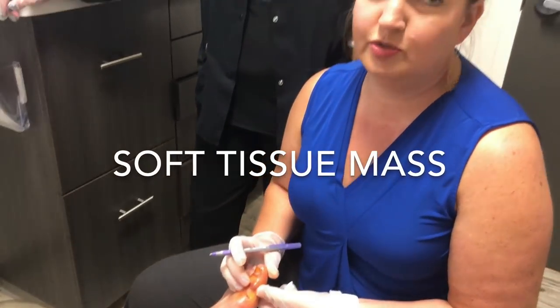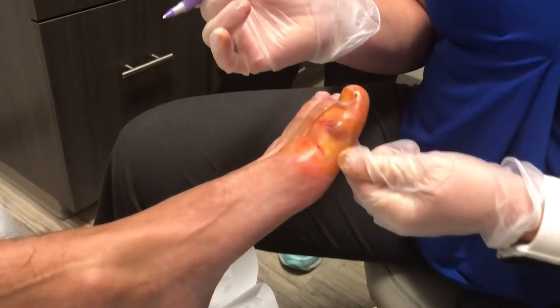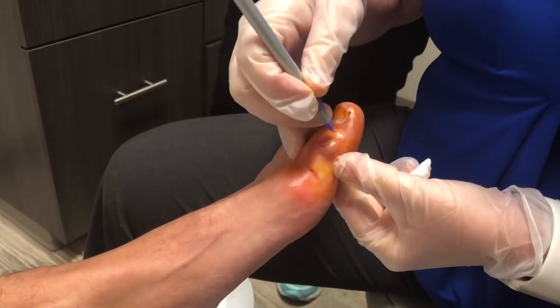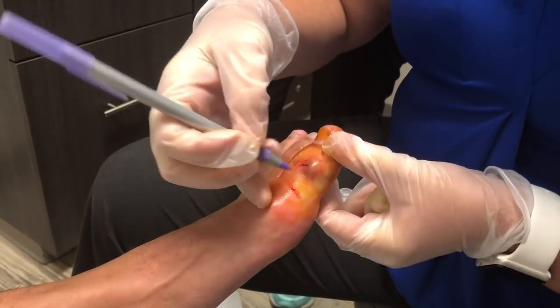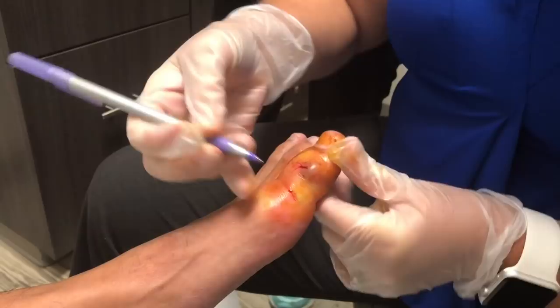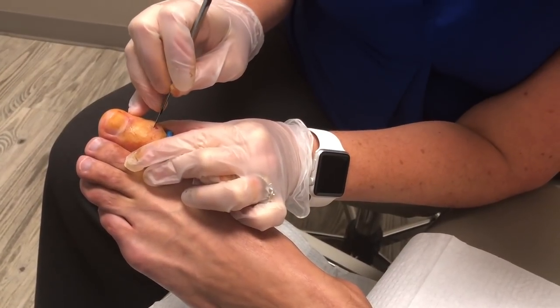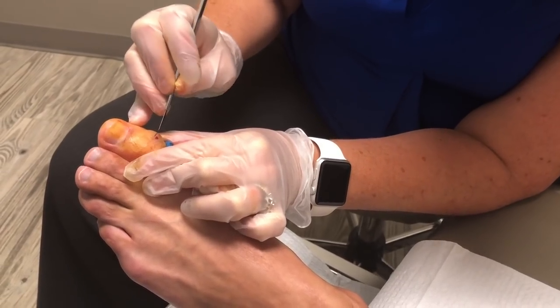This is a soft tissue mass, or a knot, that showed up on this young guy's foot a few years ago. It doesn't really bother him other than with direct pressure from shoe gear with running. We're going to try to keep him active by cutting it out — making a small incision through the skin and into the subcutaneous tissues.